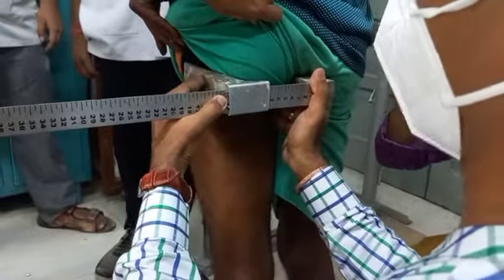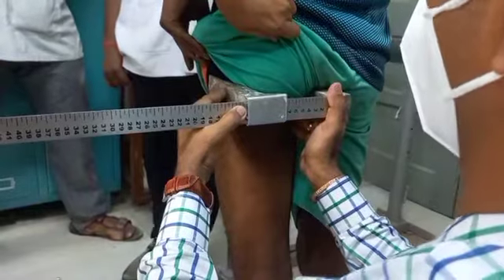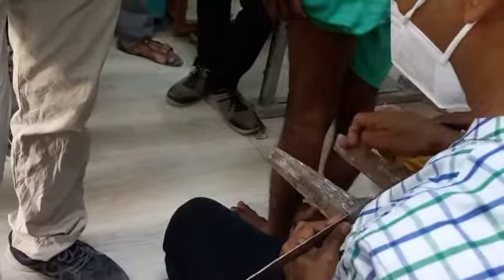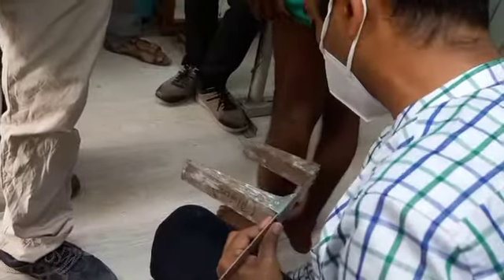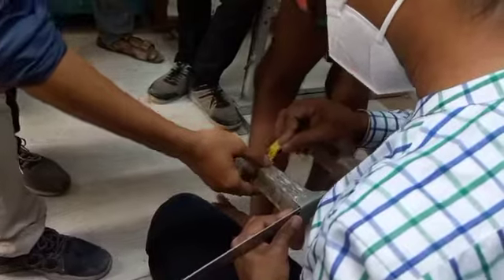What was the tape measurement that we will take? At present we are seeing this is the compression I am giving. With this compression, I know this measurement is the measurement. So this is the ramus that was loaded from the medial side, and this is the angled one, but at the same level. What is this measurement? Just measure it.